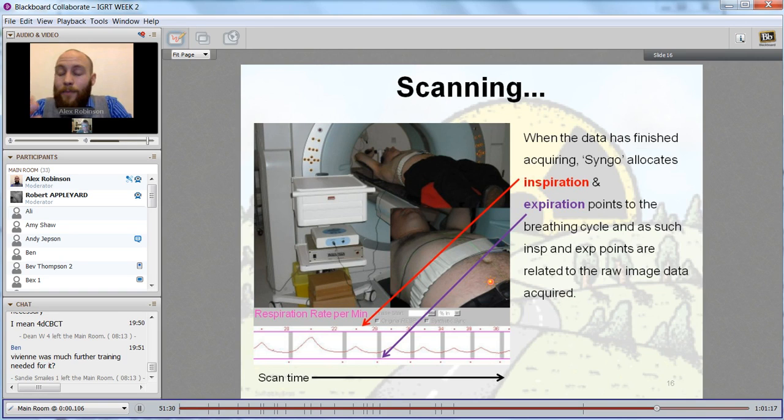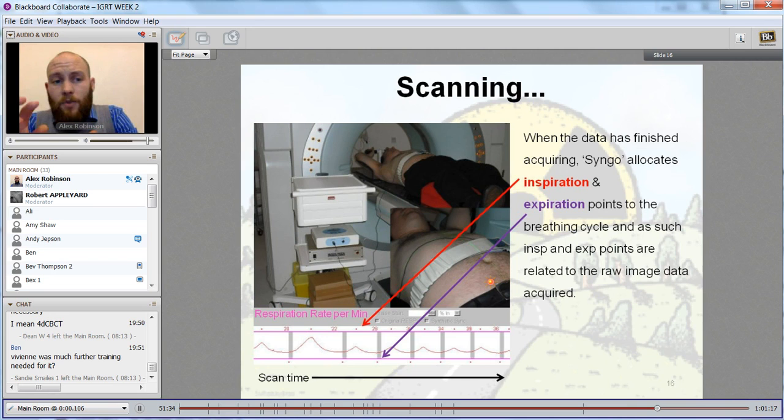From that, we have our patient setup, the fact that as well as our tumour moving, our organs moving, potentially the patient could also fidget. We've got the setup errors, which looks at our tolerances with our lasers. So essentially it's plus or minus 2 mils, so essentially our lasers could be off by 4 mils, so we need a margin to include that.